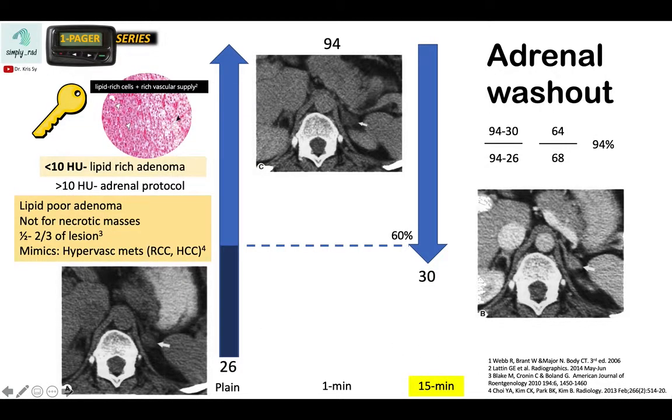Hey, good morning. Today, let's talk about the adrenal washout. To understand this, let us first start with the basic pathology. The adrenal washout is used in order to determine if a lesion is an adrenal adenoma, which is benign.